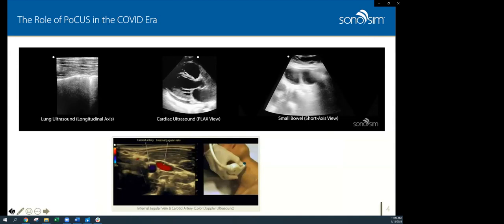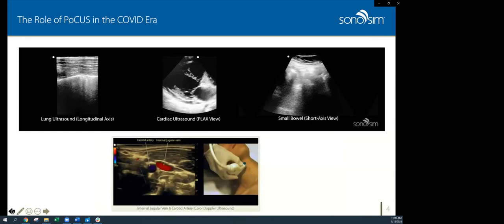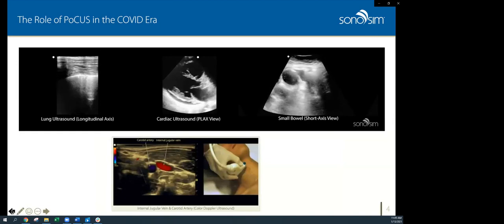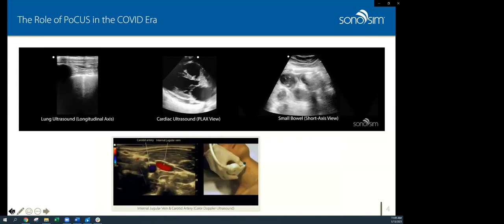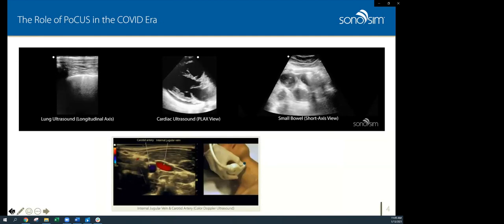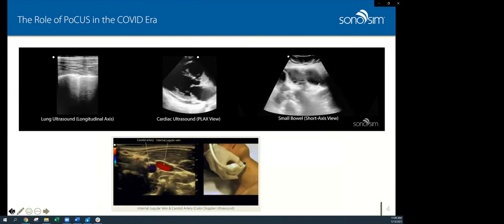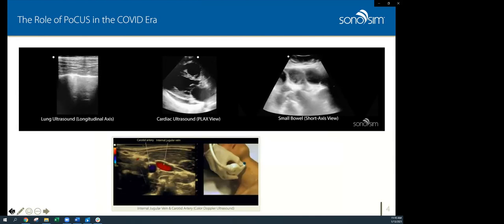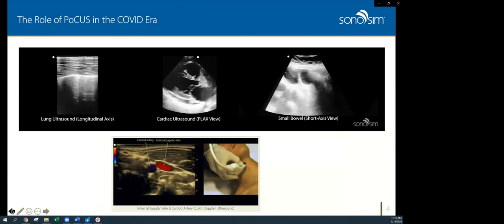And then these patients very often are critically ill. You can see how close the carotid artery in this slide is to the internal jugular vein. And when you're navigating and trying to put a catheter and a large dilator and a large needle and a guide wire into the internal jugular vein, you can see how critically important it is to be in the correct area and not accidentally puncture the carotid artery, as well as putting in peripheral IVs, which negate or preclude the need to really put in a central venous catheter. So these are just some quick examples of how point-of-care ultrasound helps in the era of COVID.